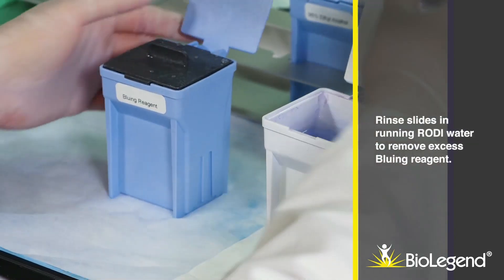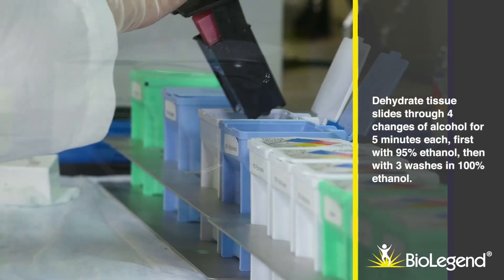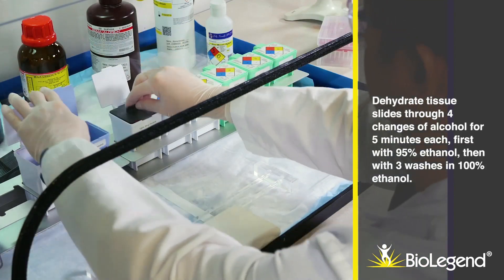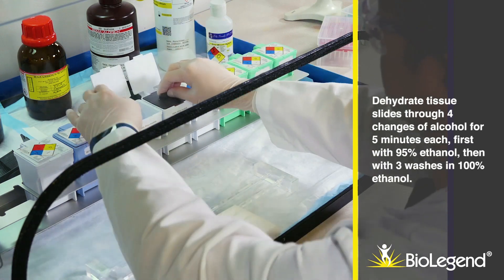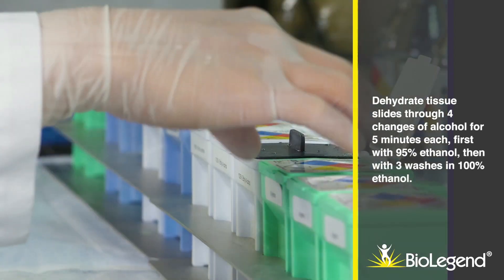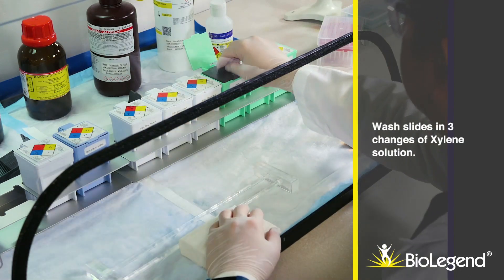Rinse slides in running RODI water to remove excess bluing reagent. Dehydrate tissue slides through four changes of alcohol for five minutes each: first with 95% ethanol, then three washes in 100% ethanol. Wash slides in three changes of xylene solution.